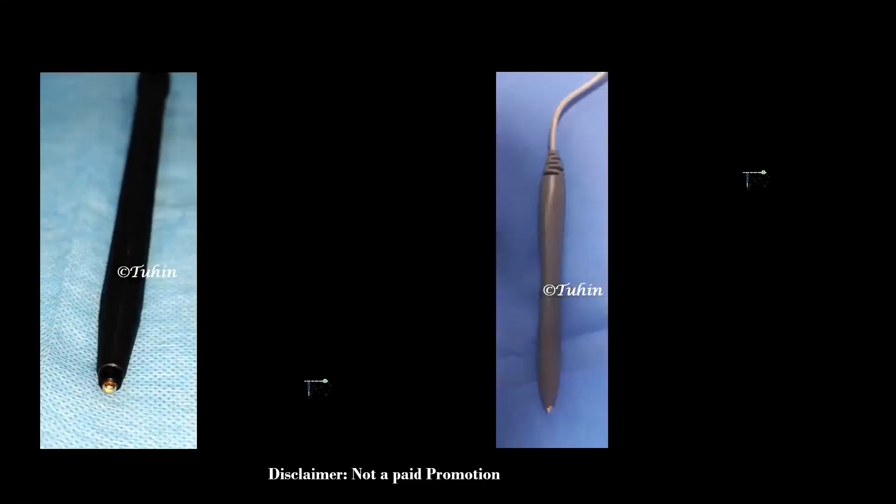Before I start, let me give you a disclaimer that this video is not any kind of paid promotion or brand endorsement. I am describing here what we are using daily in our theater. This pen device is used for percutaneous electrical nerve stimulation. Many of you must be using it in your practice or you might have seen this in various RA workshops. It is an excellent tool for teaching surface anatomy because it provides a non-invasive technique for localization of a peripheral nerve to facilitate the nerve or plexus block.